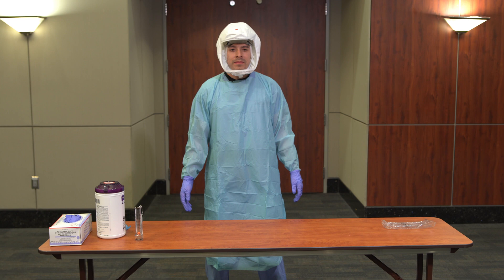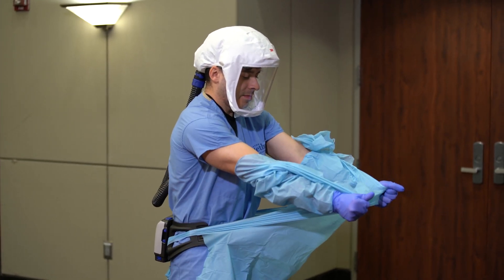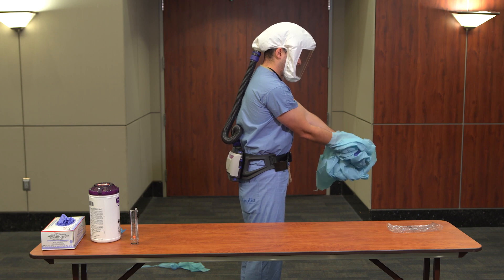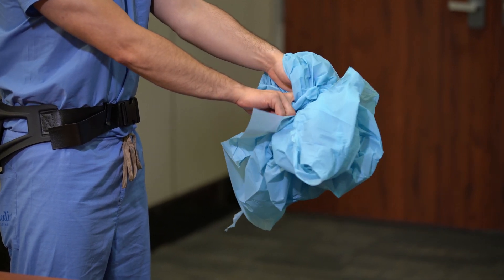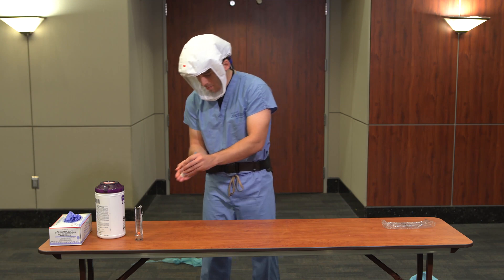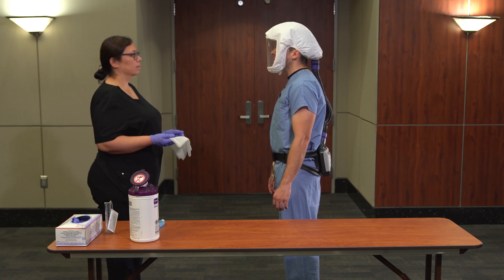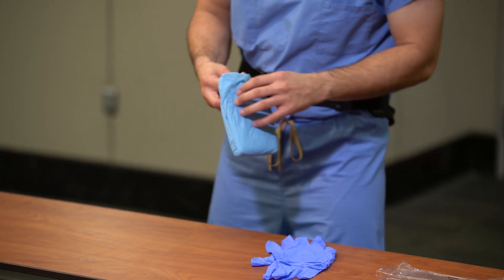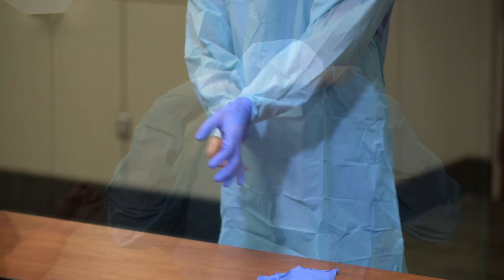In the event that you have to care for multiple patients suspected or confirmed of COVID-19, doff your isolation gown and gloves by grabbing the gown at the chest and pulling forward, then at the waist and pulling forward. As you are removing the gown, peel off your gloves at the same time, only touching the inside of the gloves and gown with your bare hands. Place the gown and gloves into a waste container and perform hand hygiene. The buddy should perform hand hygiene, don a clean pair of gloves, and use a disinfectant wipe to wipe the front and top of the hood. The healthcare worker should then don a new isolation gown and a new set of clean gloves.